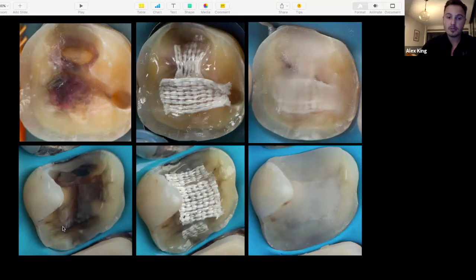Again, here on the bottom left, we have our prep for an onlay. Here it's been immediate dentine sealed, and it looks like it's been resin coated as well. And then this is your dentine replacement composite, the first layer, the 0.5 millimeter, the 1 millimeters, which I discussed as part of the bio base. And then they've stuck Ribbond into the bio base and covered. So this is a bit more advanced.